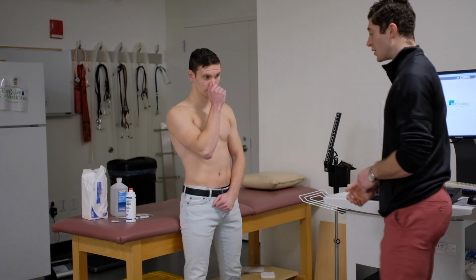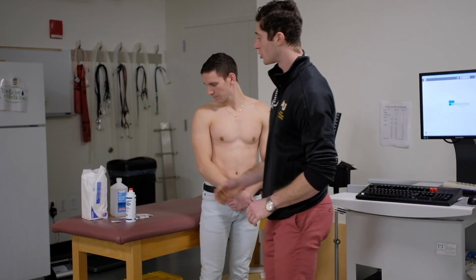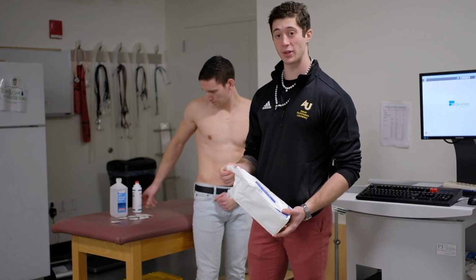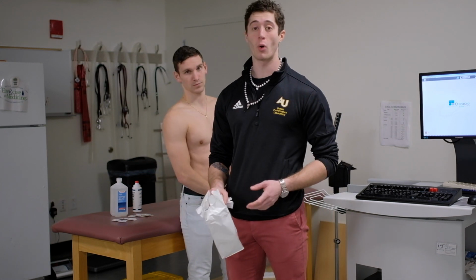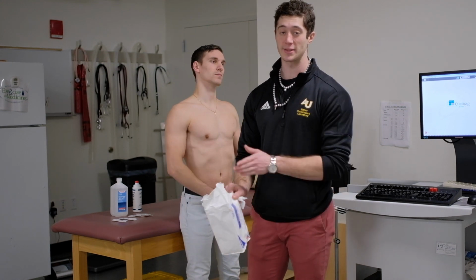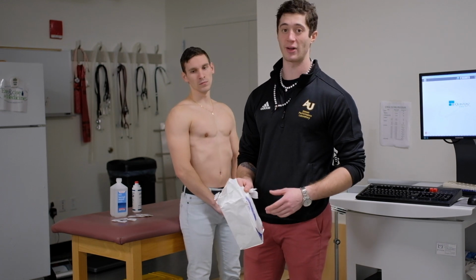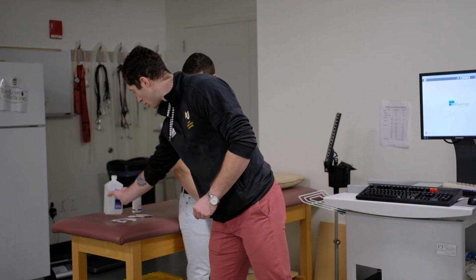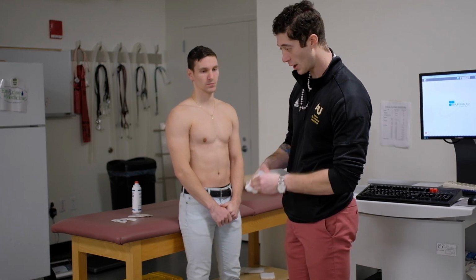What we'll do first is we will take some gauze and alcohol and wipe down the different spots of the leads. Generally, it's best practice to take one piece of gauze to wipe down with the alcohol and then another piece of gauze to dry. Go one by one, or at most do two. If multiple are in the same spot, you can do that entire spot. However, we want to make sure that the skin is as fresh as possible and doesn't have any oil on it. So we'll go ahead, we'll put the alcohol on the gauze and go through the sites.